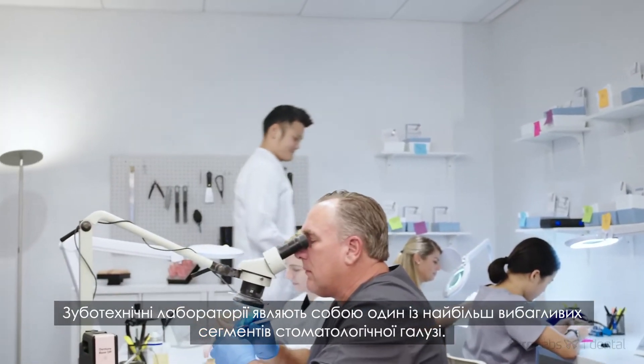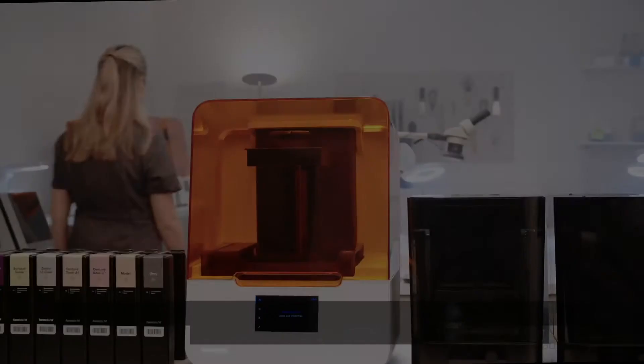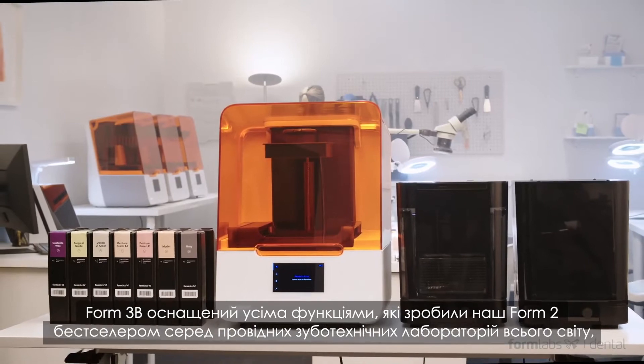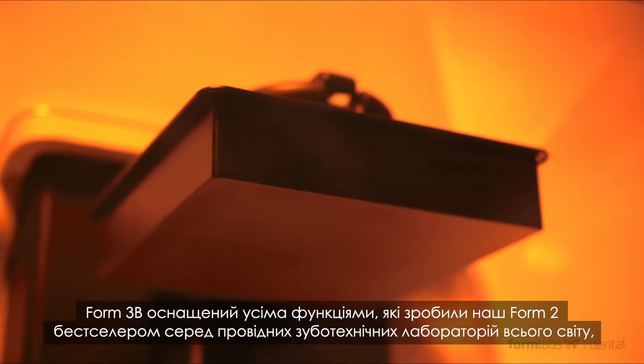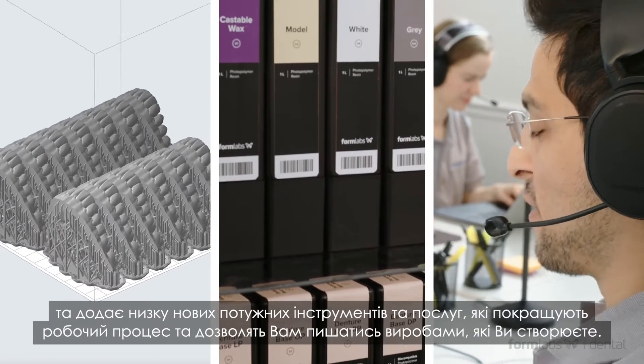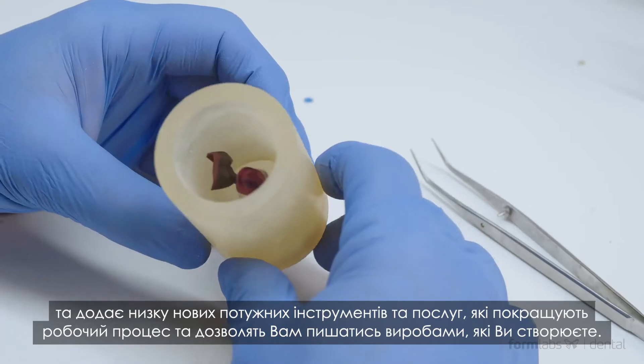Dental laboratories represent one of the most demanding segments of the dental industry. The Form 3B builds on all the great features that made our Form 2 printer a hit with major dental labs all over the world and adds a suite of powerful new features and services that will enhance your workflow and make you proud of the parts you're delivering.